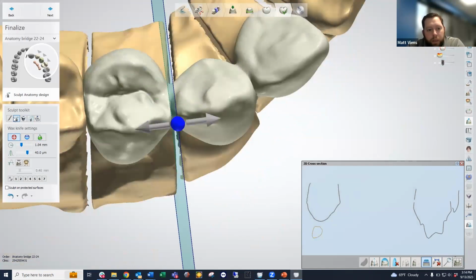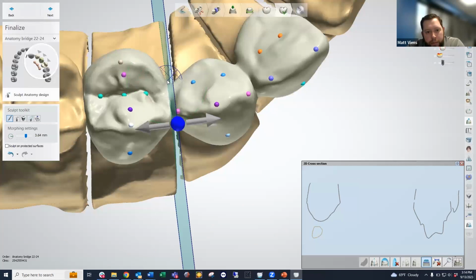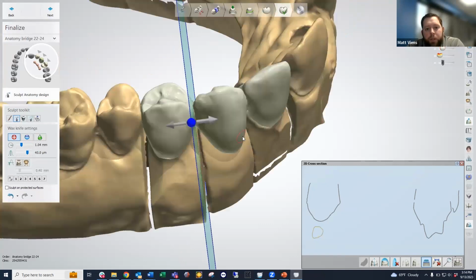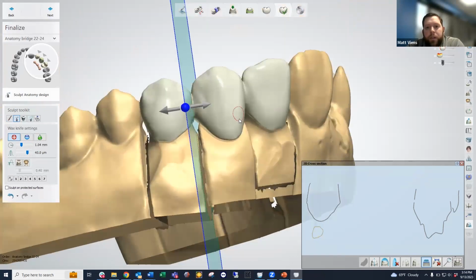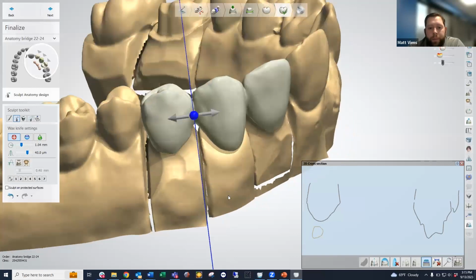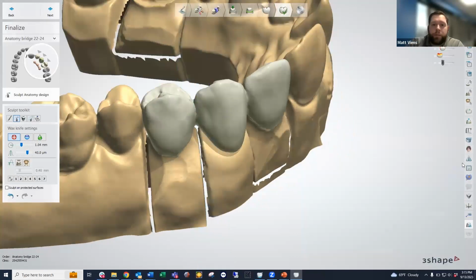I can either click and drag this area out a little bit, which allows me to increase that area, or I can use the adding tool and add to that specific area as well. Those are ways that we measure those contact areas, and achieving that 12 millimeters squared on the anteriors is important to the structural rigidity of those bridges. Then we like to look for at least 15 millimeters squared when doing full contour zirconia on posteriors. So anything from premolars backwards, we look for 15 millimeters squared. Okay. Any other questions?